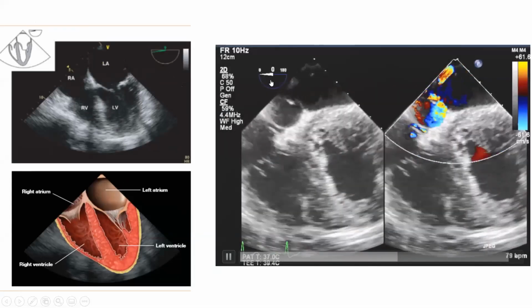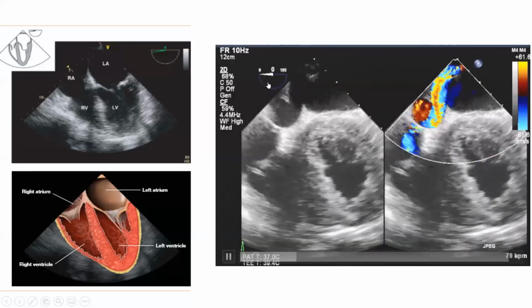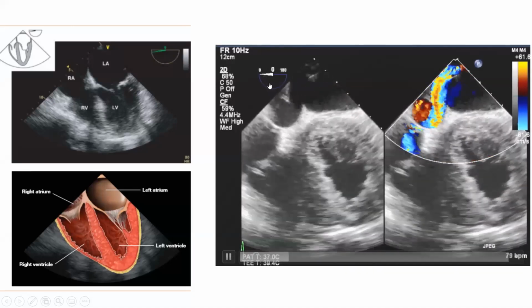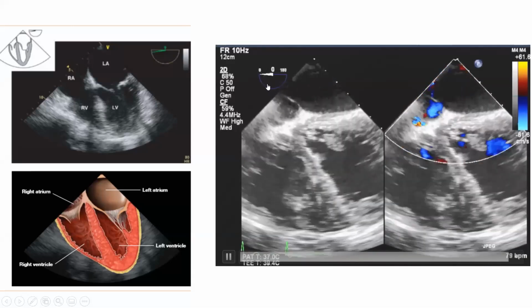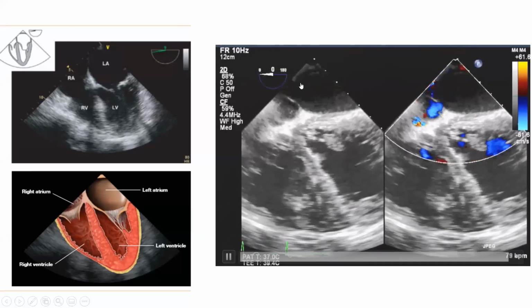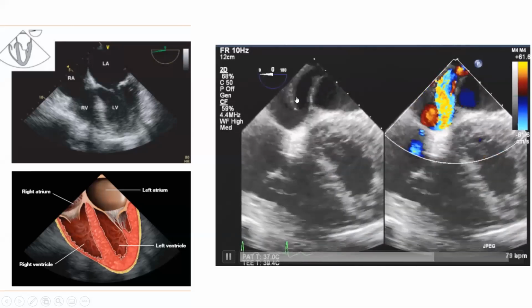Then still I am in zero, still in the mid-esophageal view. I didn't change anything. Just the probe is inside the mid-esophageal view. I pull it a little bit up. I get 5 chamber. I will push it now a little bit down, 2 centimeters down before the stomach. I will catch this one. What is this structure? What is the most posterior structure?